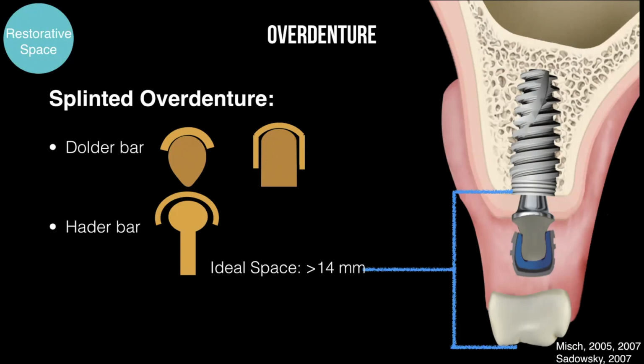Okay. I already took the teeth out, and she is healing. I did that about a month and a half ago. But because of how the bone is, it's so much a valley, in the posterior there's no bone, and the only bone that really exists is in the area between, let's say, 20 and 28. I want to place the 2 implants there, but how do I fill in the posterior? Is it just going to be a bunch of acrylic?